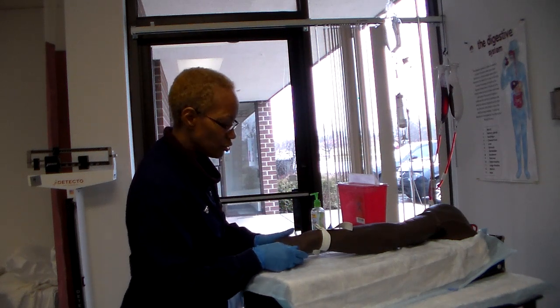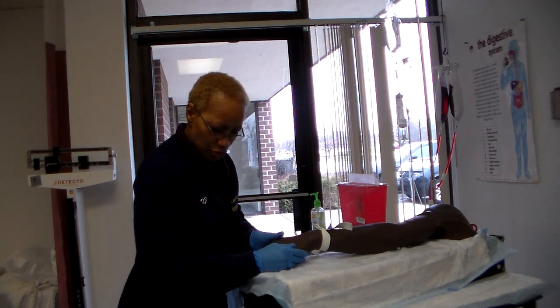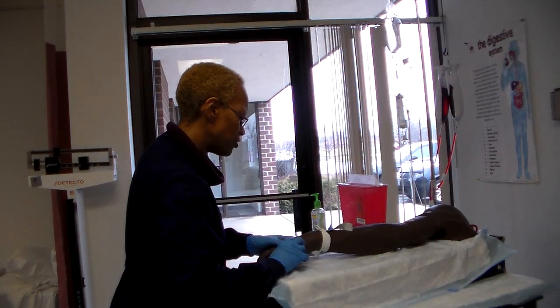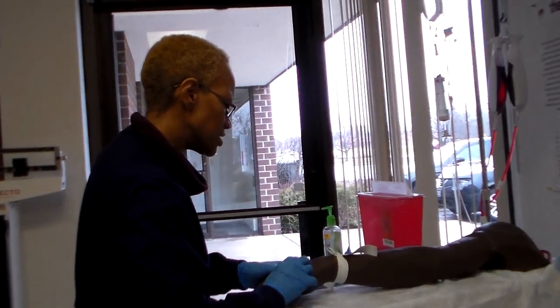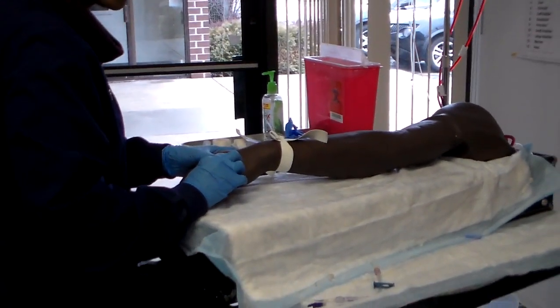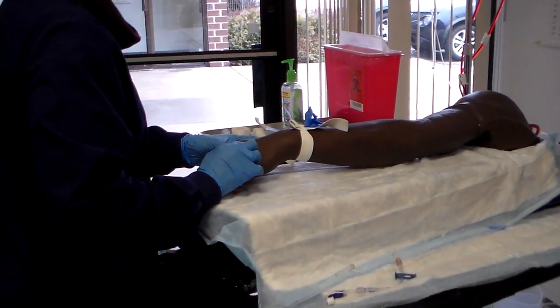Okay, and then you're going to select your vein using your thumb to pull down on the vein, and you're just going to feel the vein for resilience. Does it bounce back? That means once you push down on the vein, it should give you a nice bounce under your finger.